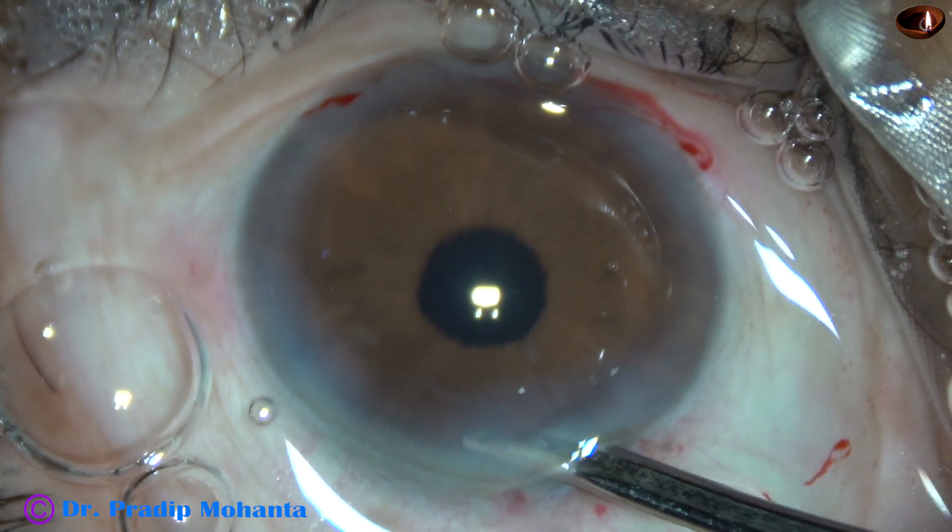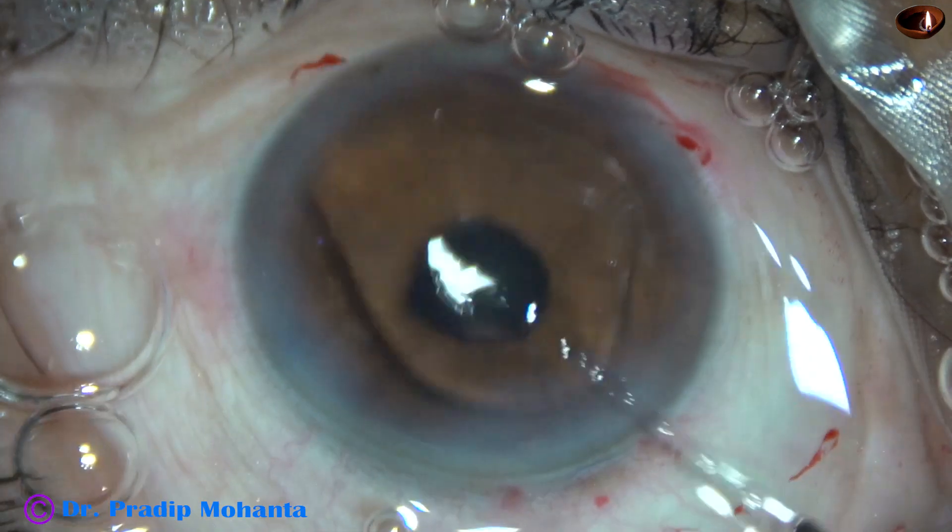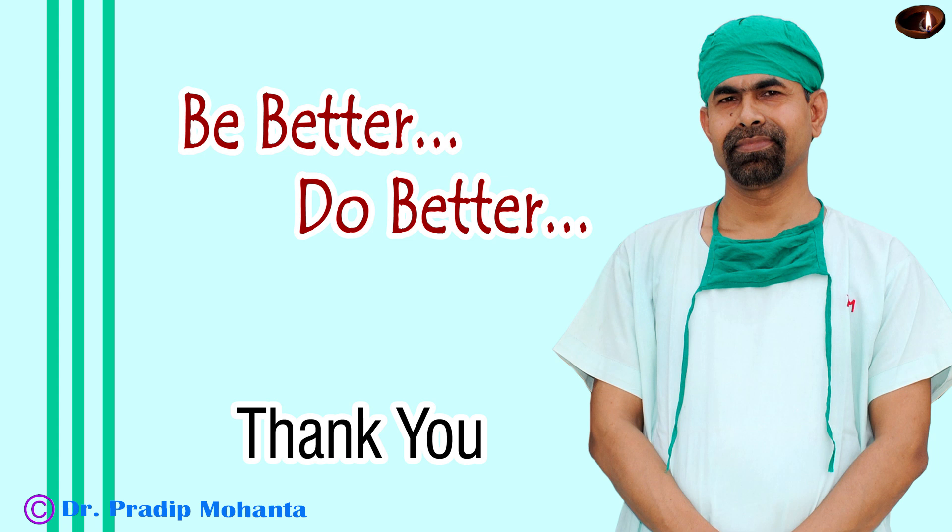In this case, we have clearly seen the use of the B-hex pupil expander. Thank you very much for your attention. I hope this video will help you develop your surgical skills. Please use any kind of pupil expansion device in small pupils — it makes surgery very safe. If you don't have a pupil expansion device, use iris hooks. It is acceptable if we cause some sphincter damage, but protecting the corneal endothelium and posterior capsule is more necessary.